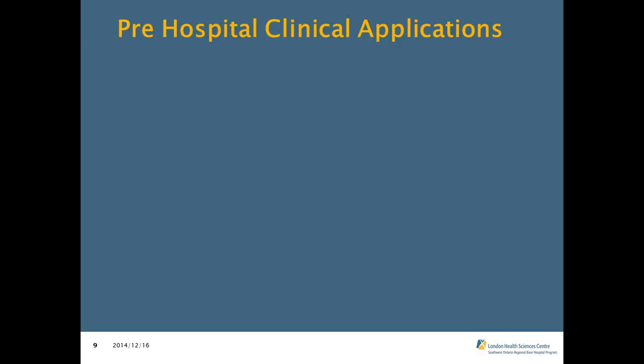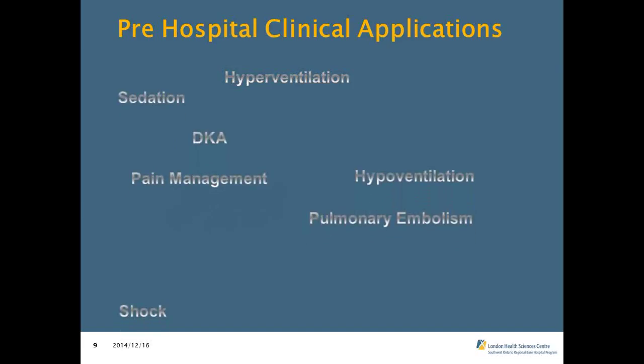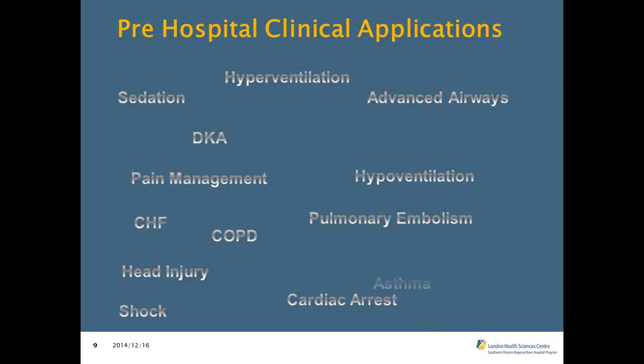Good. So let's look at some of the pre-hospital clinical applications for EndTidal CO2 monitoring. There are very many, as you can see: advanced airway management, pain management, some suspected pulmonary embolism. Unfortunately, we won't be able to touch on every single one of these clinical applications today, but we will certainly touch on a few. And if you have any questions, again, you can submit them via the webinar.